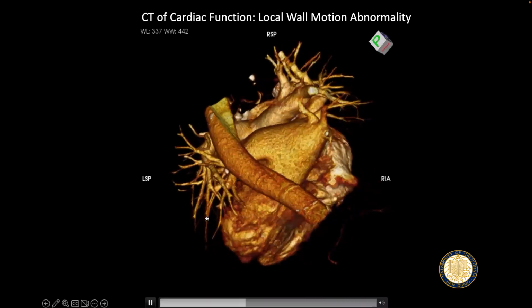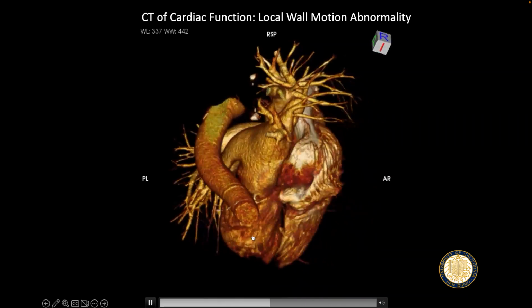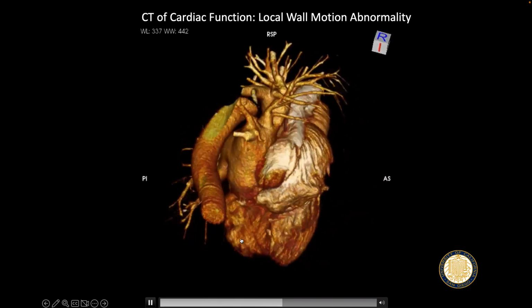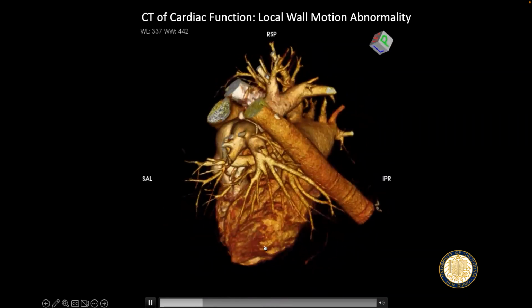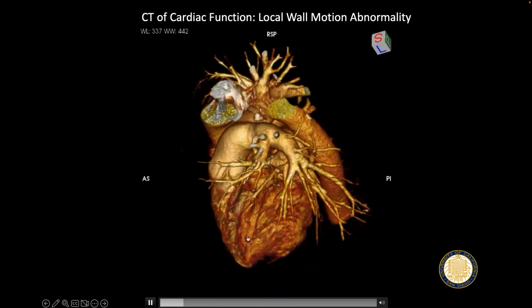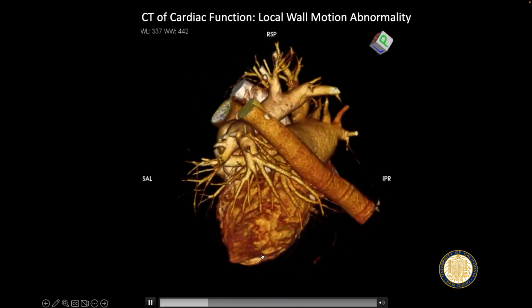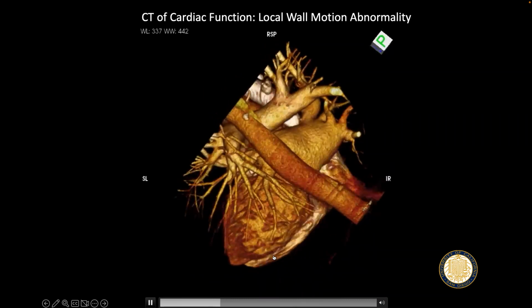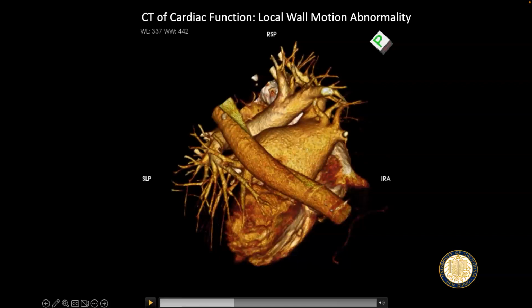And this piece of tissue above this, remember, this is the blood. This is a cast of the heart. The tissue obviously above that is not contracting because it just isn't. Over here, you have sort of normal contraction. These nooks and crannies are getting pushed together. These are not. So it's a really direct way of visualizing if you have an abnormal heart.